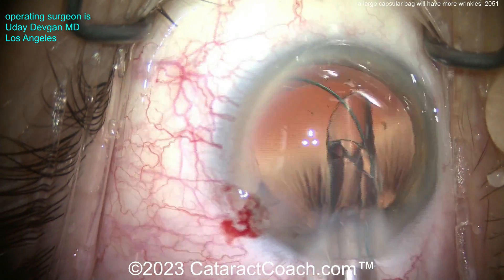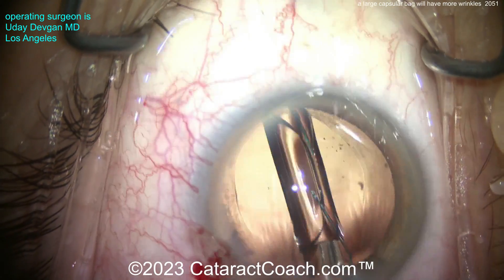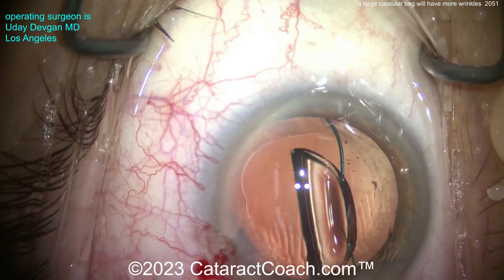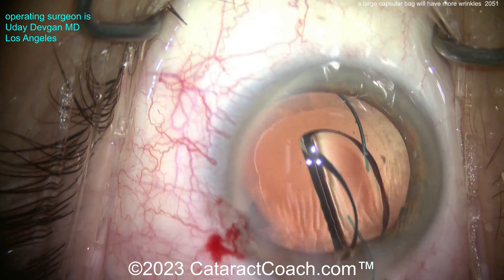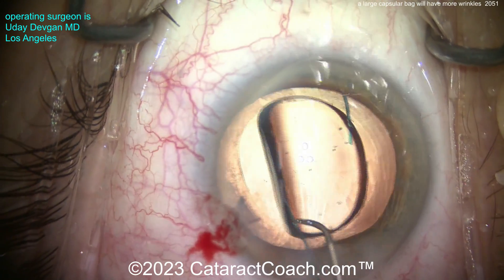As we know, the leading haptic should come out like the number seven — the seven-L rule. There's the seven, here comes the optic, and then the trailing haptic like the capital letter L. Seven-L rule. Therefore the overall configuration of the haptics is the anti-S. Remember: S is for stupid. The haptic should not look like the letter S.